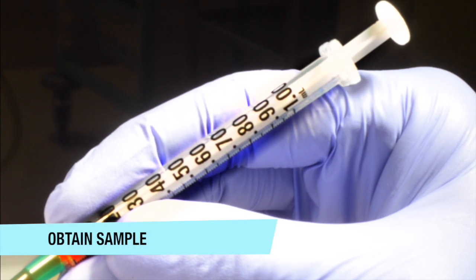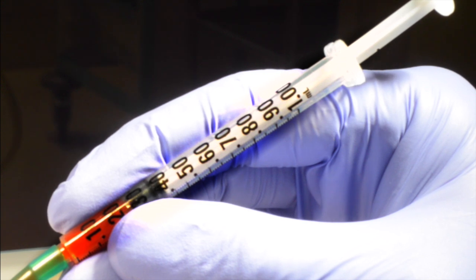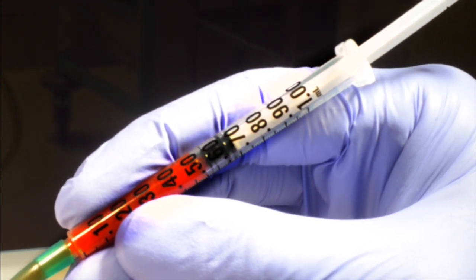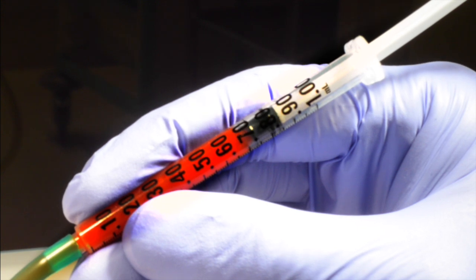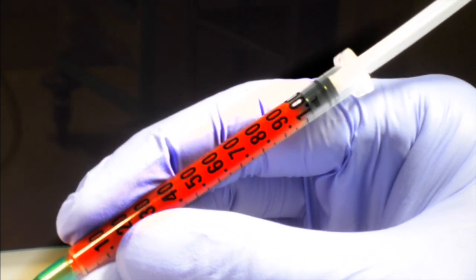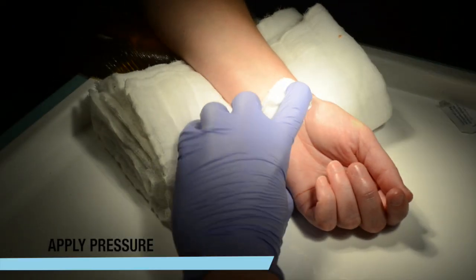Once the needle has been inserted slowly into the artery, it should start to fill with arterial blood under its own pressure. Note here how the arterial blood is a red colour, whereas venous blood is often a dark bluish colour.